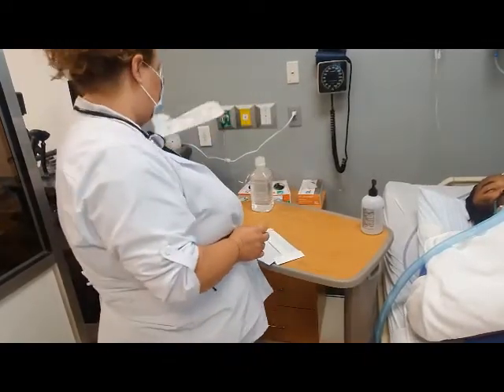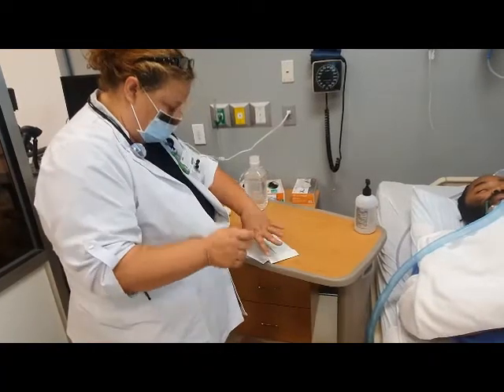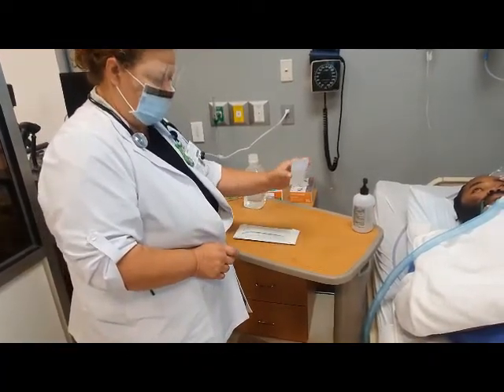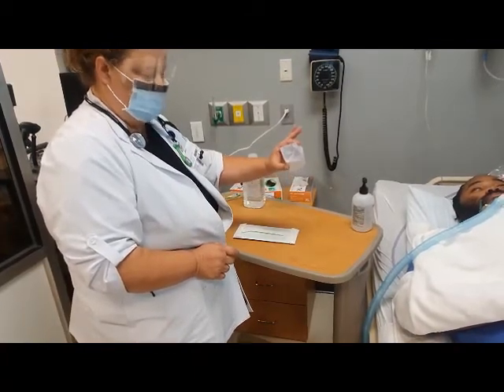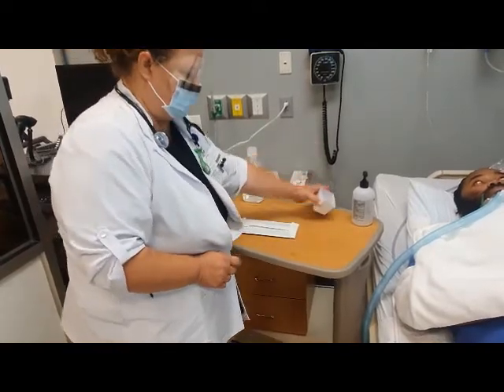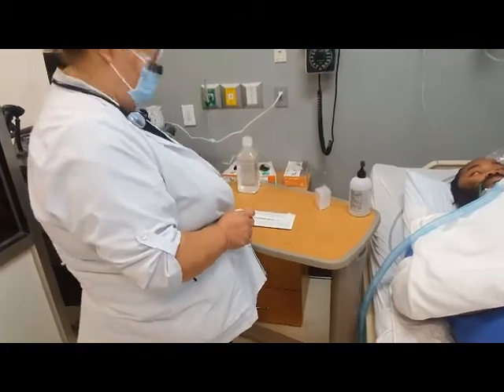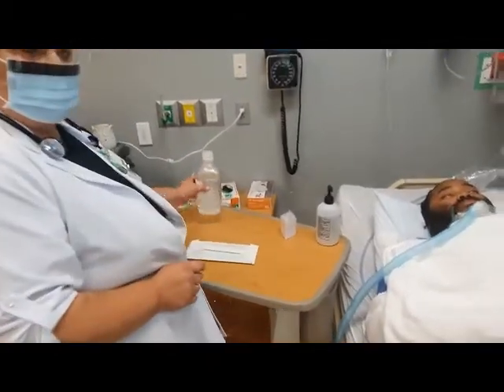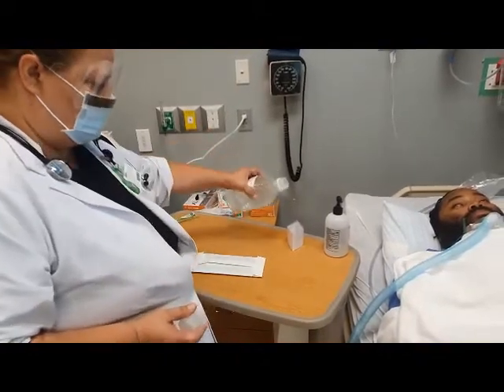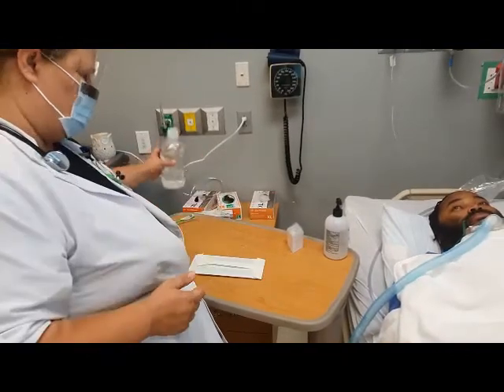You'll take this and dispose of it in the garbage. Now, this right here, you can touch the outside rim only, and you open it up. You do not want to touch the inside because that is considered a contamination. You set it aside back here. Go ahead and fill with your sterile saline. Then you take the sterile saline and pour it in, and then you set it aside.